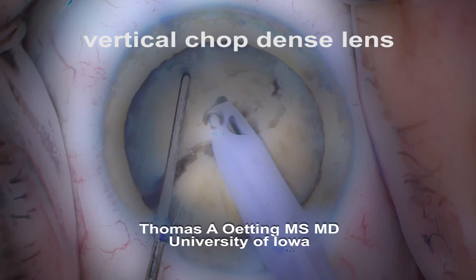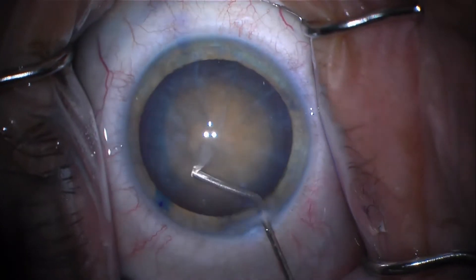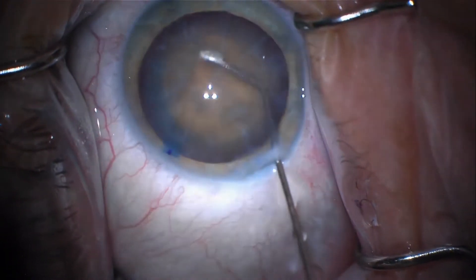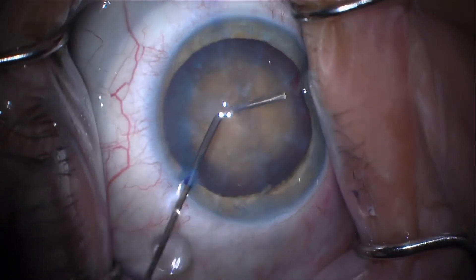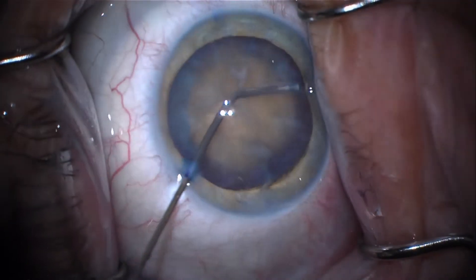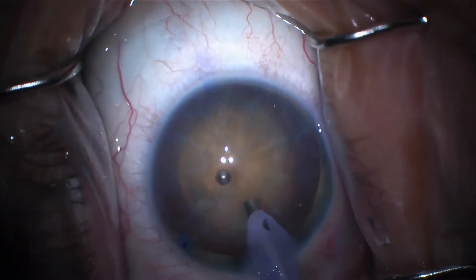Hi, this is Tom from the University of Iowa. I'm going to show you a video of a surgery where I was operating and I was doing vertical chop. You can see it's a dense cataract. I'm doing hydrodissection and I'm trying to lyse the synechiae between the capsule and the lens. You can see I'm going around about 360 degrees to try to just manually lyse that.